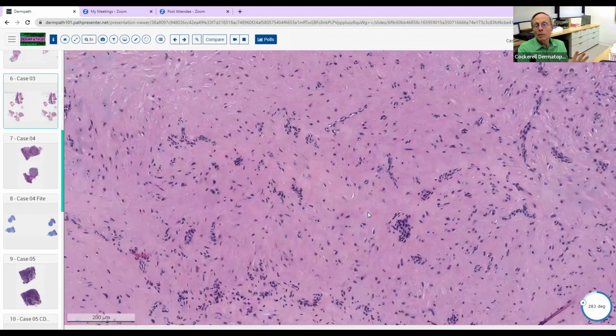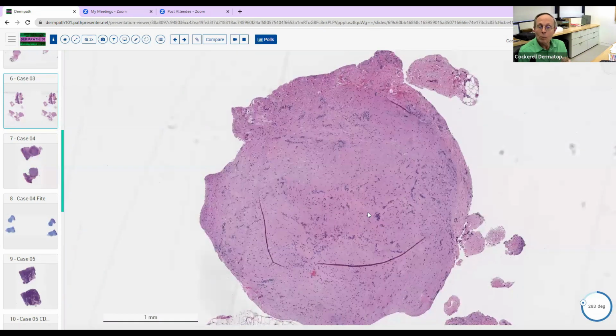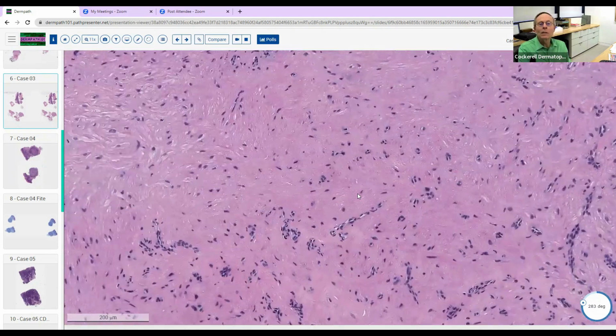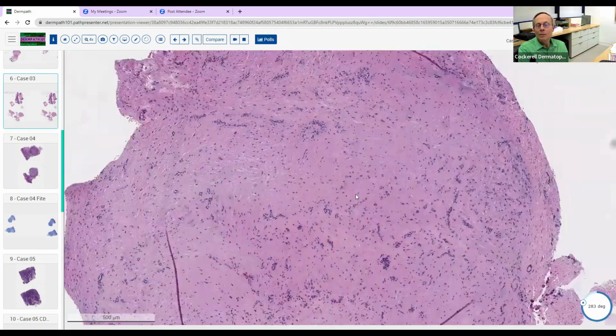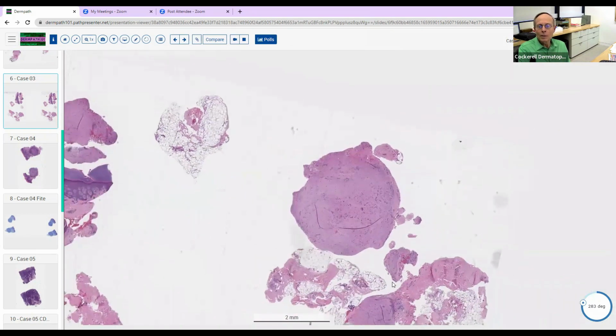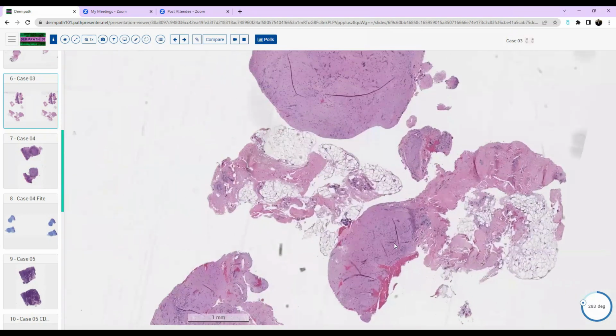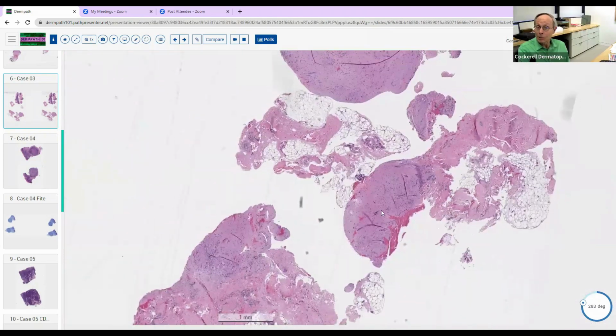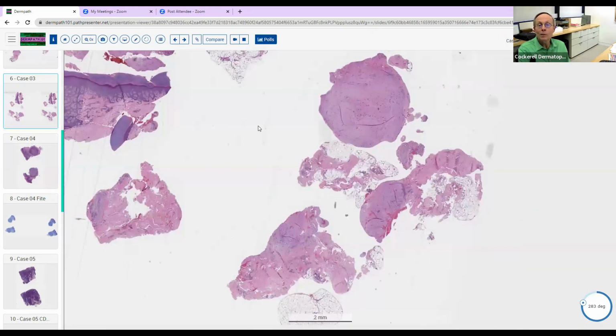And the other thing that you can also see is a giant cell tumor of tendon sheath or a fibroma of tendon sheath. If you biopsy those early, you'll see fibroblasts, osteoclast-like giant cells, and fibrosis. Then as time goes on, those cells gradually go away, and you're left with this sort of change here. So that's basically in the family of these fibromatoses. I don't think you need to become a soft tissue tumor expert, but make sure you know about this entity. And to get the biopsy, you have to take a deep incisional biopsy, because if you do a shave or punch, you're probably not going to get the lesion. Got it.